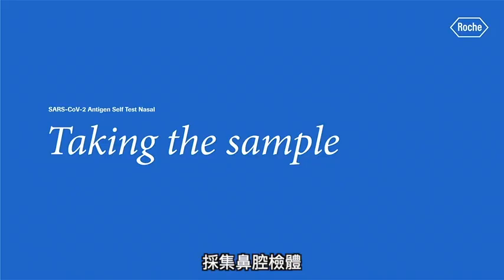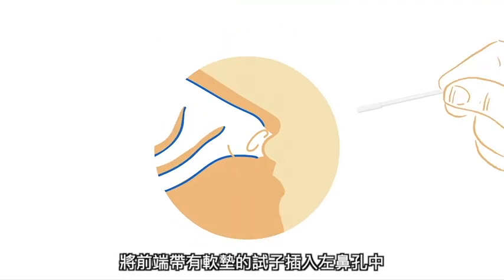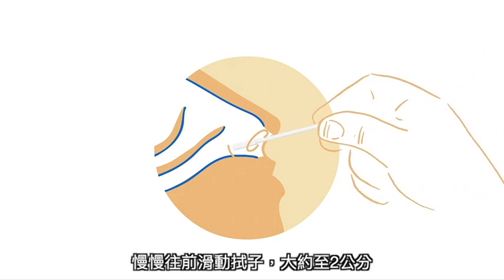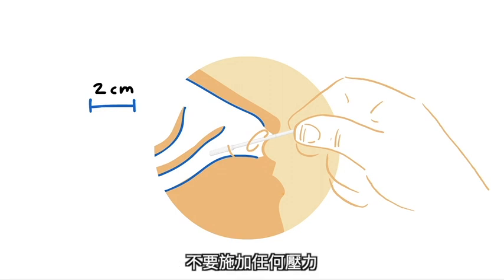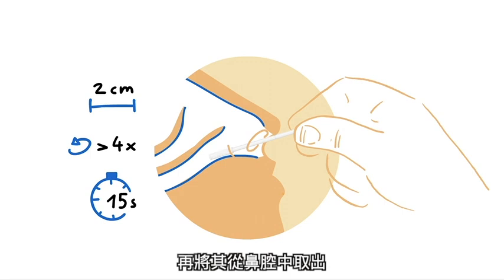Take the sample. Slightly tilt your head backwards. Insert the swab with the soft pad at the front into your left nostril. Slowly slide the swab about 2 cm forward, parallel to the roof of your mouth, not upwards, until you encounter resistance. Do not apply any pressure. Rotate the swab 4 times, for a total of approximately 15 seconds, against the lining of the nasal wall before removing it from the nostril.